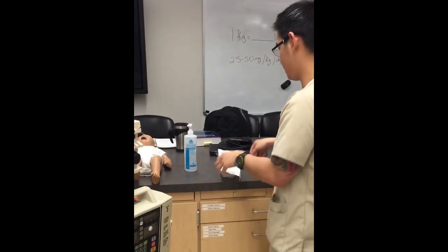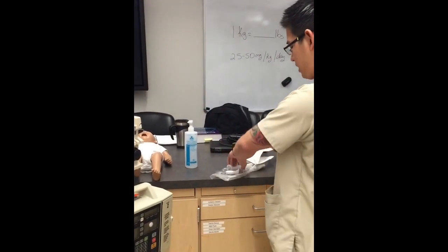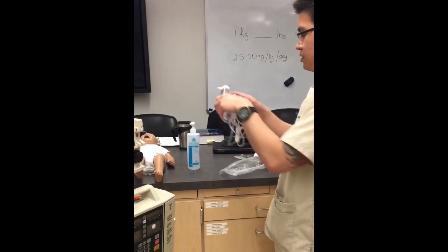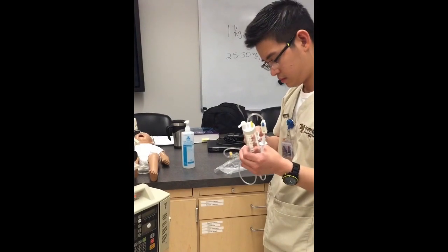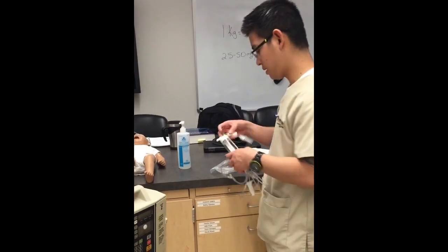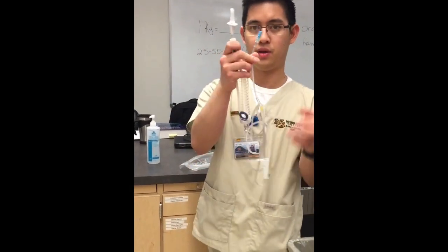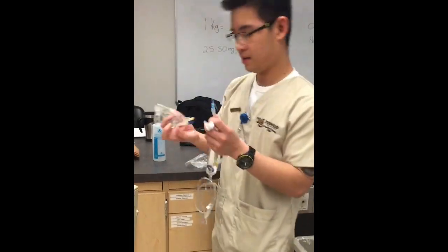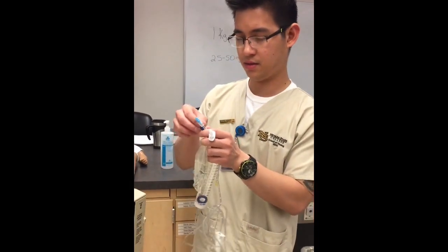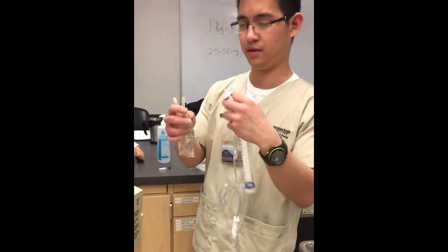So first I'm going to spike my solution. Open this first, and make sure everything is clamped. Make sure that you don't contaminate this spike, because it will go inside the infusion bag, and this one also, because it will go through your patient's IV tube. First I'm going to spike this. Be careful not to puncture the bag or contaminate it.